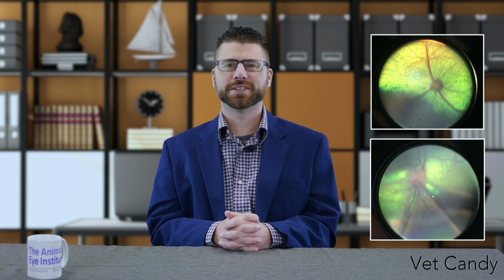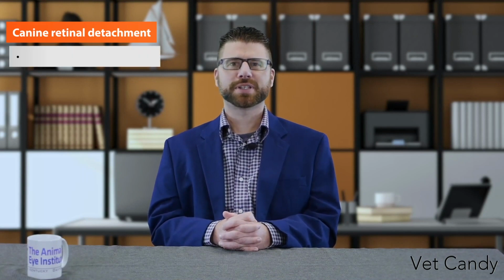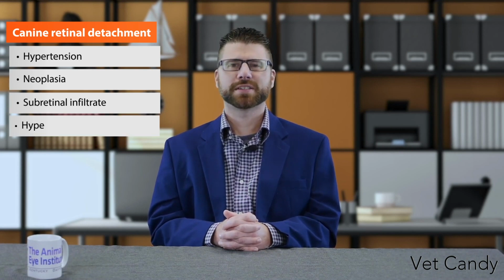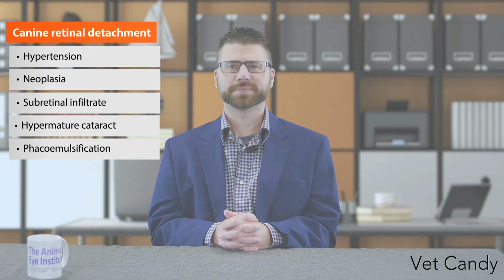In this first photo, this eye shows a reattached retina. In the second photo, the retina is still detached but is showing some improvement. With canine retinal detachments, common causes include hypertension, neoplasia, subretinal infiltrate, vitreoretinal dysplasia, hypermature cataracts, and post-phacoemulsification.